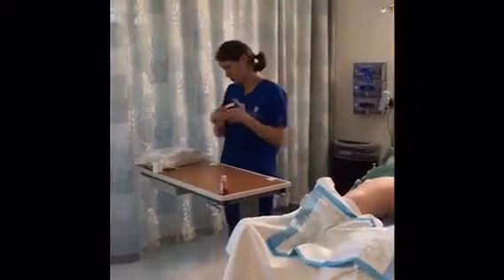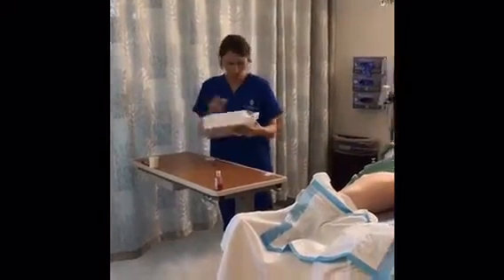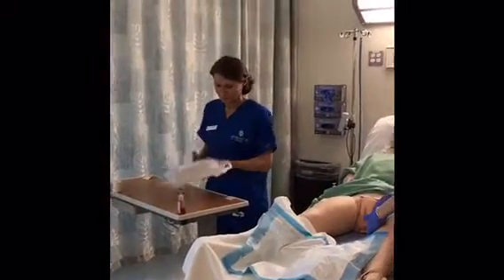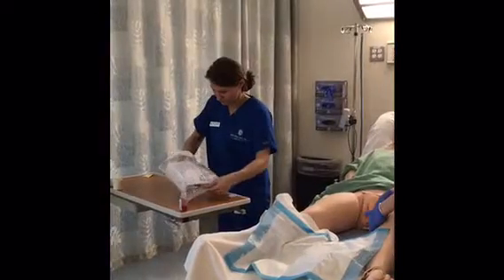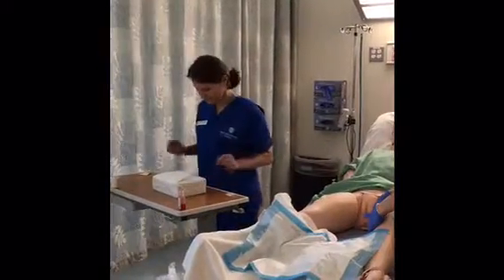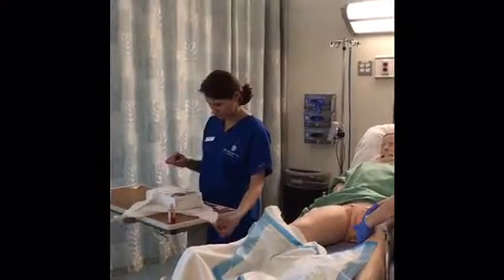Then I'm going to start to set my sterile field up. First, by checking the package, making sure it's intact. Expiration date is not expired. Make sure all the contents, everything I need, is on the front of the package. To carefully remove the box, opening the flap furthest away from me, and the sides, and the one closer to me.